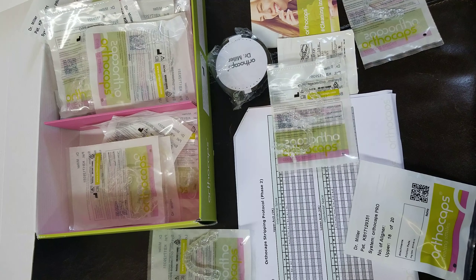My review on the treatment plan — I always give my full honest review — I really like everything they include except for the treatment plan. I think it needs work, and maybe it's a translation issue. I actually think I could understand it better if it were in German, because the translation is awkward and it's hard to figure out what's going on. It's something they could definitely improve.